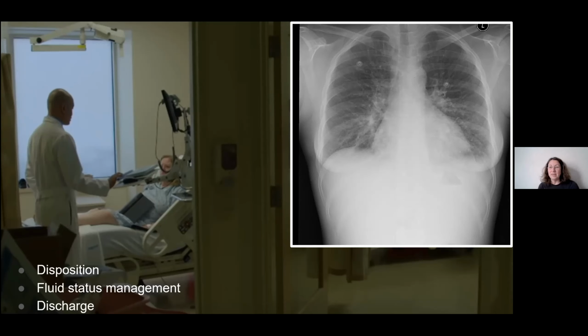Unfortunately, this also means that in order to understand how this patient reacted to medication or what their lungs looked like in previous visits, since heart failure is a chronic condition, you again have to look at the previous X-rays, which usually means that nobody does, and the images just sit in the archival systems without contributing potentially valuable information to future encounters with the same patient.